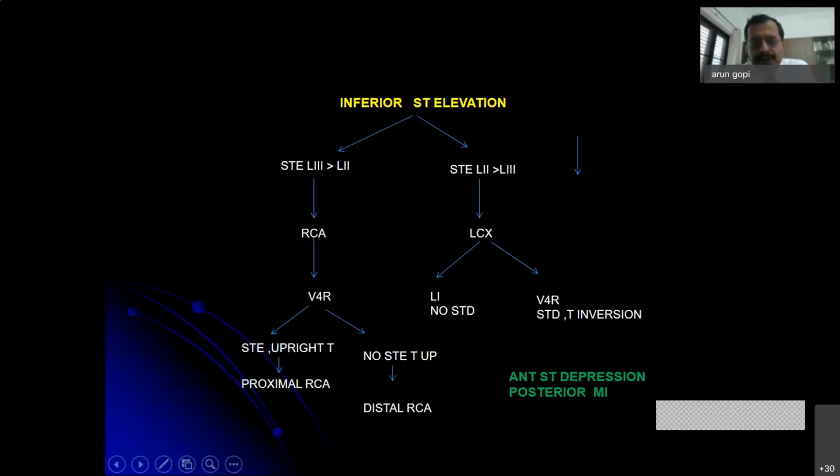It is not only useful for diagnosis of ST elevation or non-ST elevation myocardial infarction, it also gives us an idea about the therapy that we give. 90 minutes after a therapeutic intervention or a pharmacological therapy with streptokinase or a thrombolytic agent, if you find more than 70% resolution of ST segment changes, it is very specific for a complete opening up of the culprit artery. In addition, you can find reperfusion arrhythmias like accelerated idioventricular rhythm in about 50 to 70% of cases when you are taken up for primary angioplasty. So it not only helps us in diagnosis, but also helps us in understanding whether our therapy is getting effective or not.